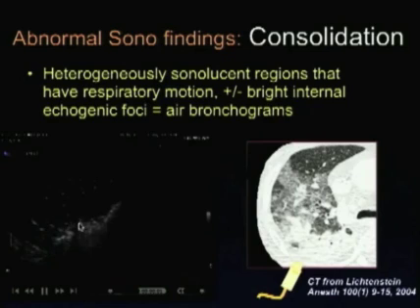And the other feature of pulmonary consolidation to notice, especially if caused by an inflammatory process like pneumonia, is that the distal side of the lung, or the transition zone between collapsed, consolidated, and normal lung, is irregular and gives rise to this very jagged appearance, often referred to as the shred sign, so named by Dr. Lichtenstein.